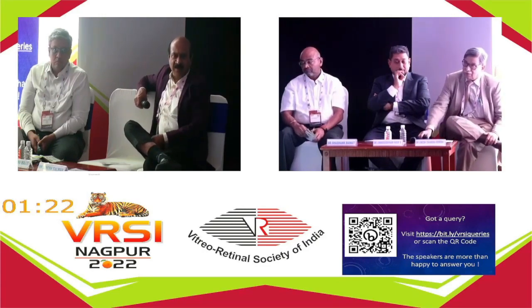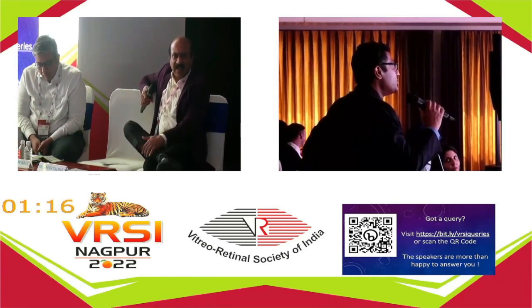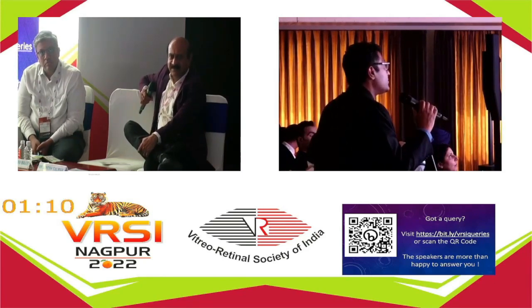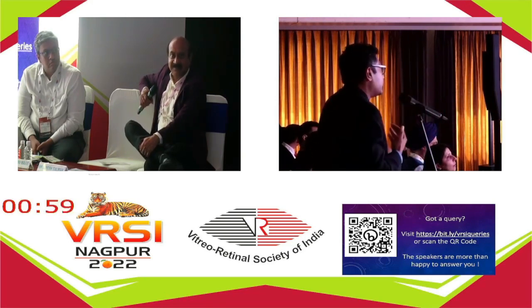No, I agree with everything that you said. I think it's very clear, as our two speakers very eloquently argued, that OCTA can't replace dye-based angiography. But there are definitely indications where it's clearly superior and beneficial. One, obviously, is in assessing non-perfusion, especially in the macula. So diabetic macular ischemia, there's no question it's much better, and there's no reason to get a fluorescein for that purpose anymore.